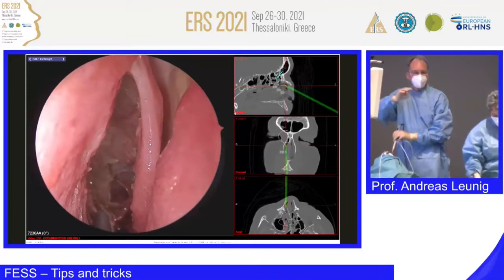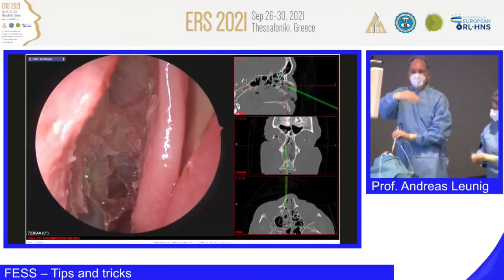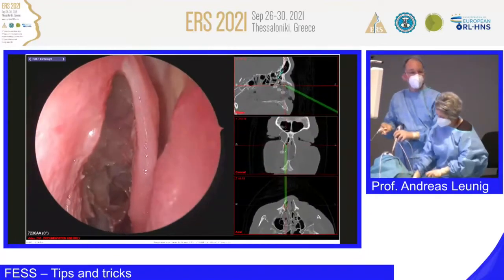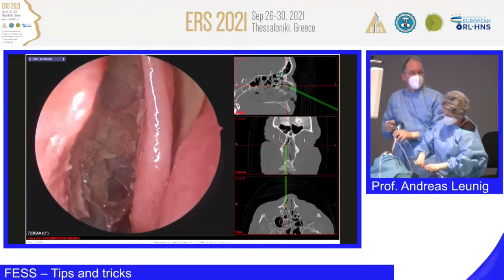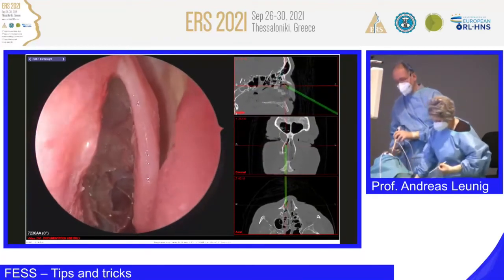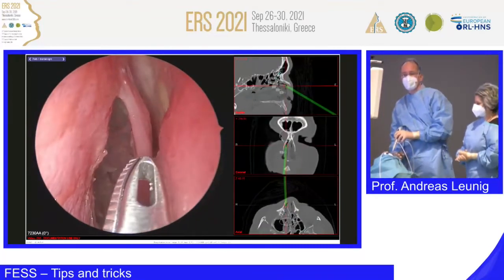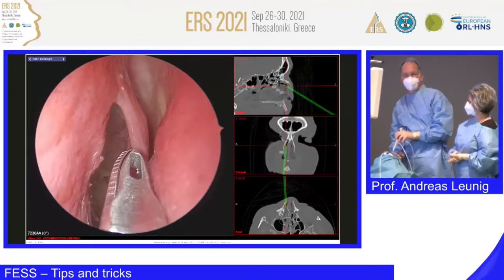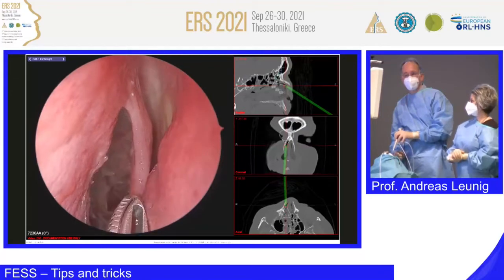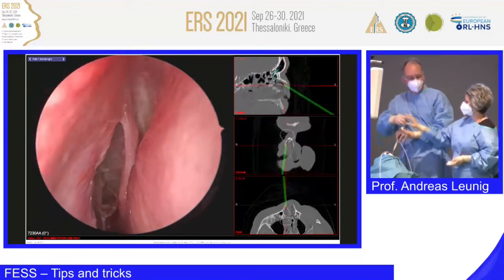So, first of all, the indication must be clear, of course. But in case you have osteomas, and I have quite a lot of osteomas, I love the type 2B approach. Many of the osteomas, not every osteoma, I can resect by this approach. But when you do it, first of all, you have to enlarge the access. And then, how to do it? You have to resect a part of the middle turbinate, and usually you make an axillary flap, with my sickle knife.